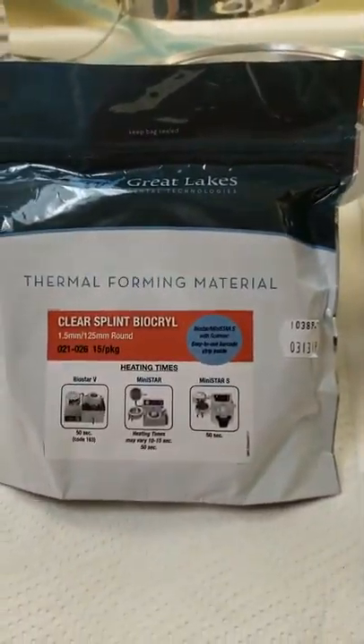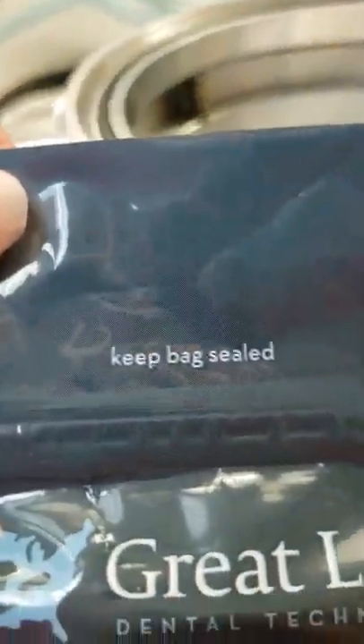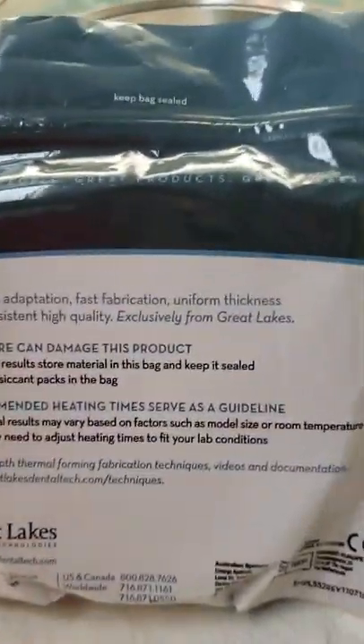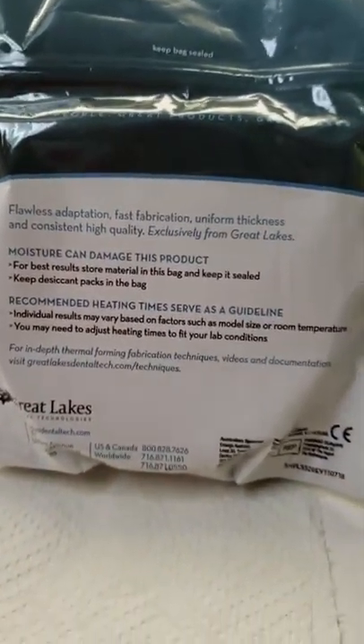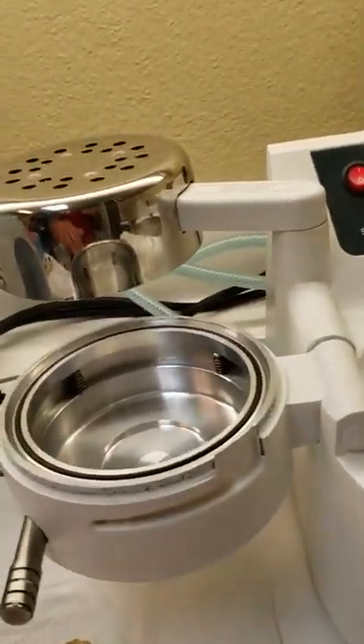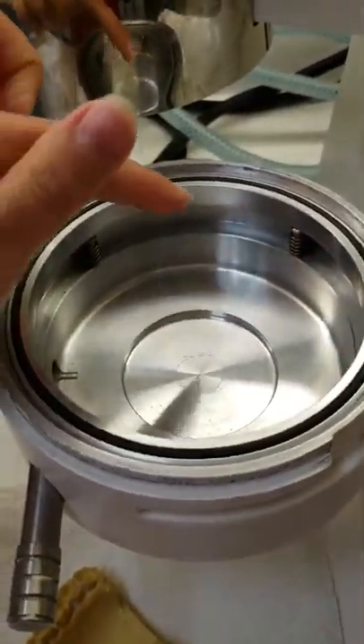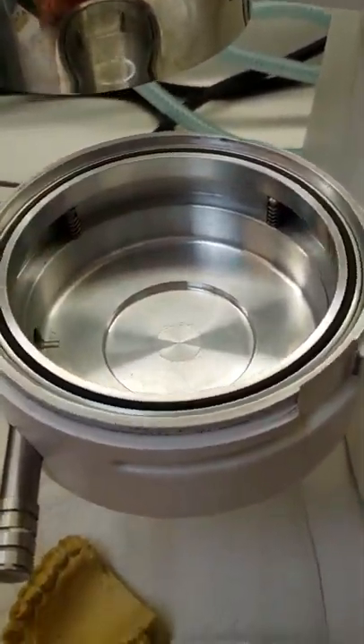Here is the 1.5 clear splint material. It is extremely important that the bag is sealed shut as soon as you're done getting material out — it says right on there 'keep bag sealed.' If moisture gets in, it ruins the tray material. When you heat it up, you'll see little air bubbles, and that's how you know the material has gone bad.